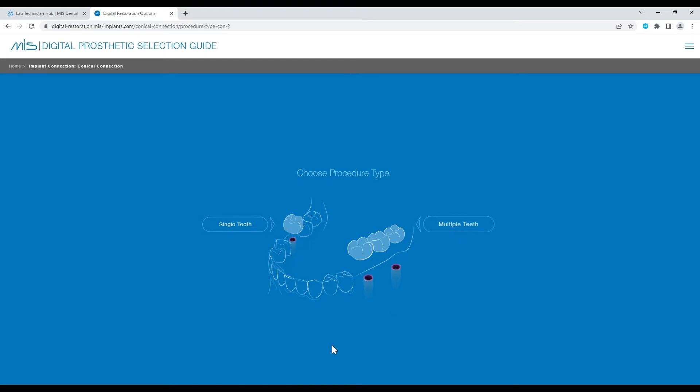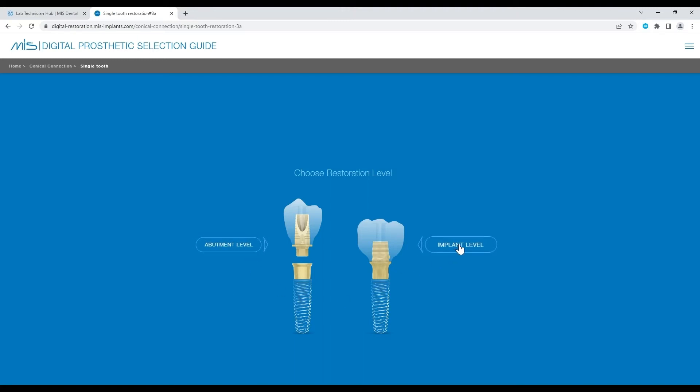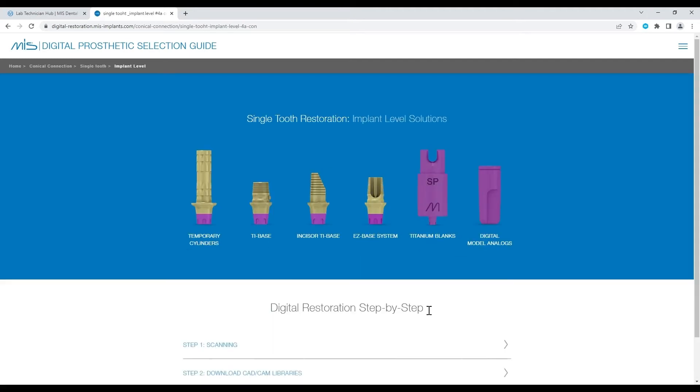For this demonstration, I will choose to restore a single tooth. Choose abutment level if you use components such as multi-unit or connect abutment. I will choose an implant level procedure.